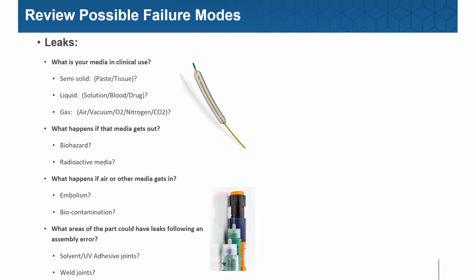Excellent question. The funny thing is that we seldom see such a wide variation of feasibility as we do with the term balloon catheter. For example, if we're talking about a cardiovascular catheter that potentially has a stent applied to it, or maybe it's used for dilation of a blood vessel where it's being expanded.